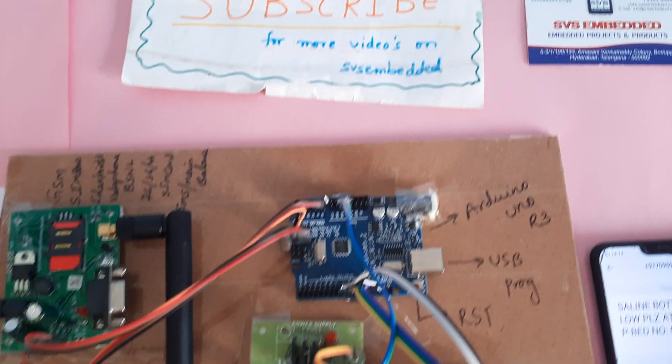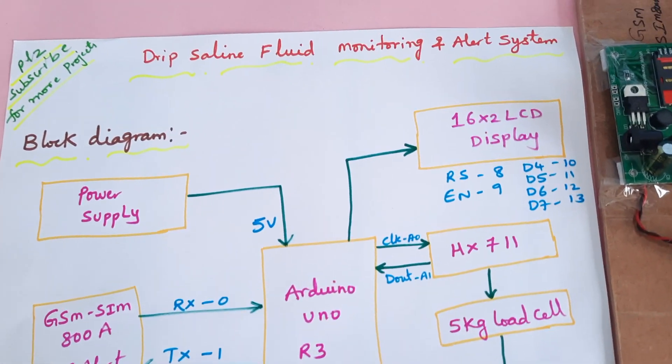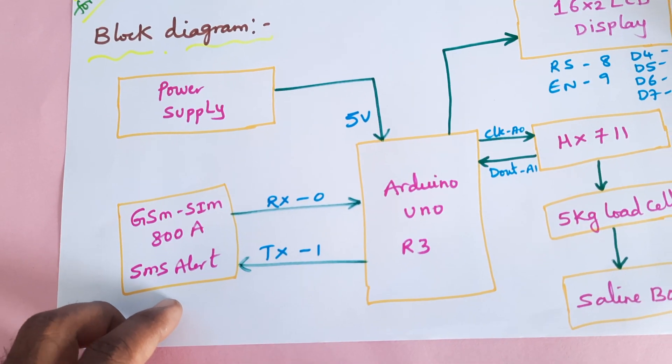Hi, we are from SVS Embedded. The project title is Drip Saline Fluid Monitoring and Alerting System using Arduino Uno R3. Here we are using GSM SIM 800A.